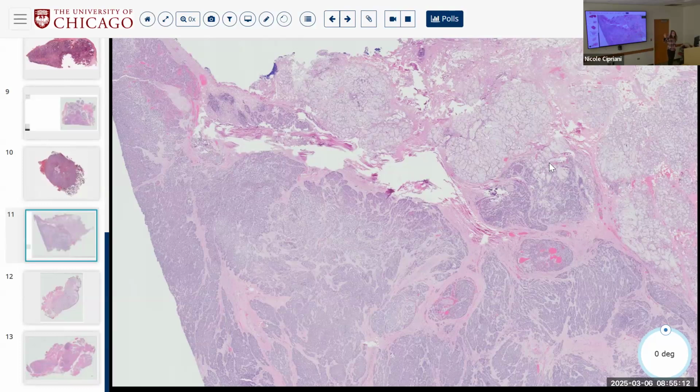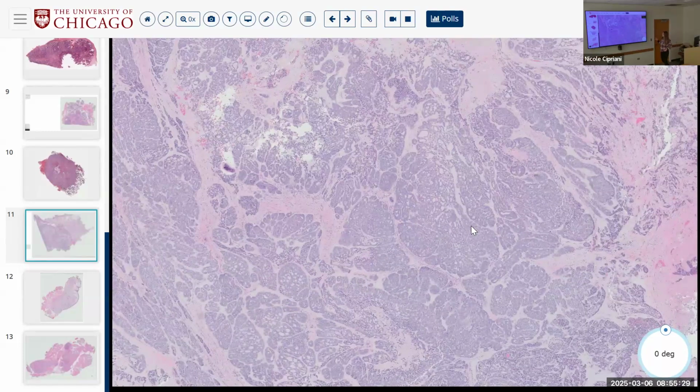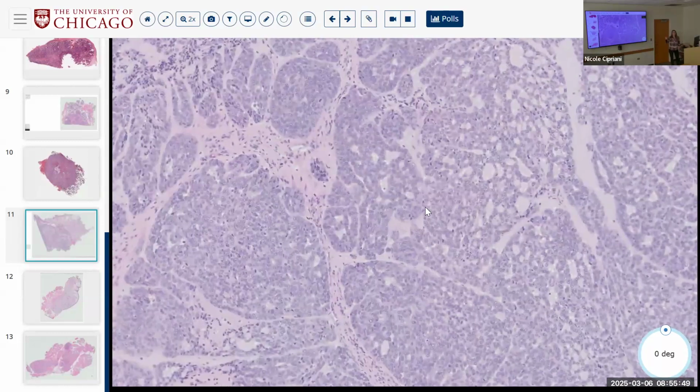Also, genetics. What are the genetics of polymorphous? Also starts with a P, PRKD1. PRKD1 mutations or fusions in the cribriform variant. So polymorphous is one of those that I think we are now becoming much more familiar with what it looks like. If they're more circumscribed, they've been misdiagnosed as pleomorphic adenomas because the ducts were mistaken for having bilayers. They're misdiagnosed as adenoid cystic because they have infiltration and PNI on the palate. So just be very cautious. But we have good morphology, and we have good immunomarkers that can help us differentiate.